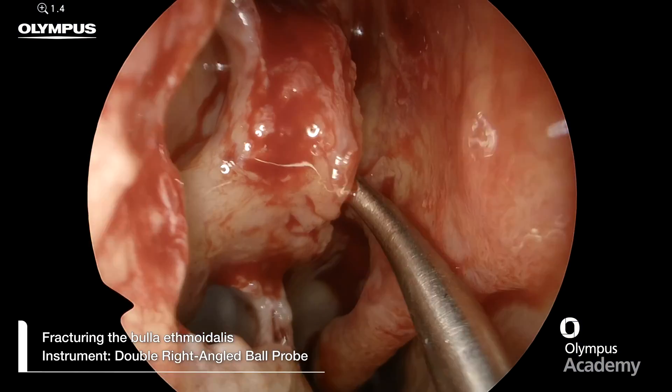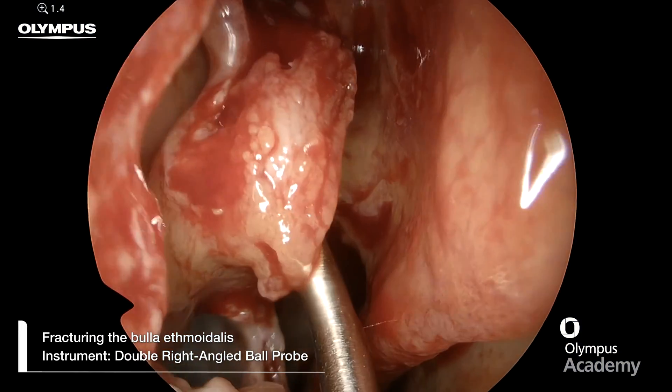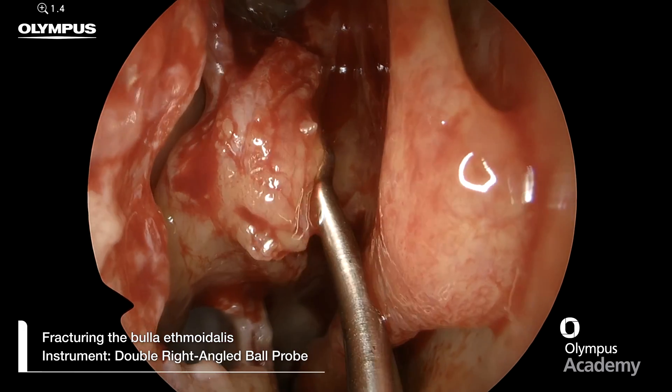Once the uncynectomy has been completed, we can move on to complete the anterior ethmoidectomy and address the bulla ethmoidalis.